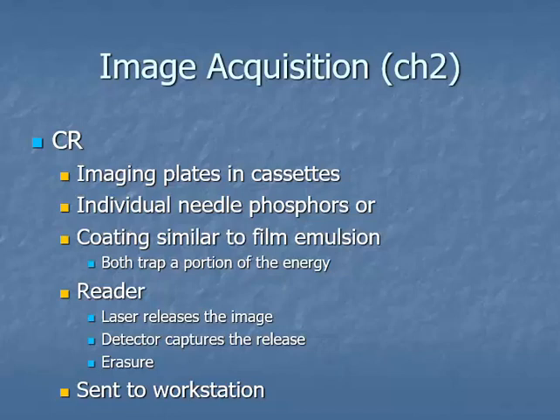And the purpose for the laser is to release that energy that's stored up. So you've got two different things going on at the same time. You've got the laser stimulation, but you've also got the light detection. The detection of the light and the amount of energy that the phosphors absorb determines how much light is left or released from those individual phosphors.